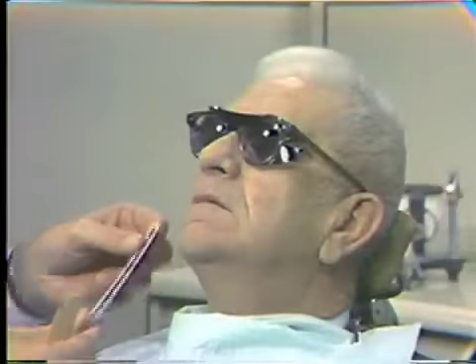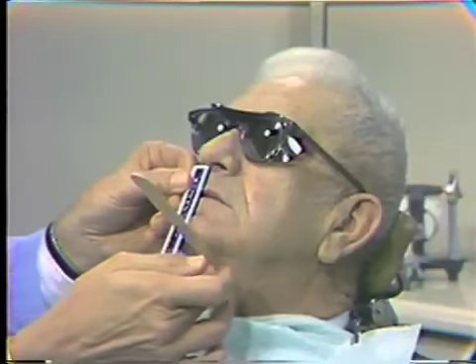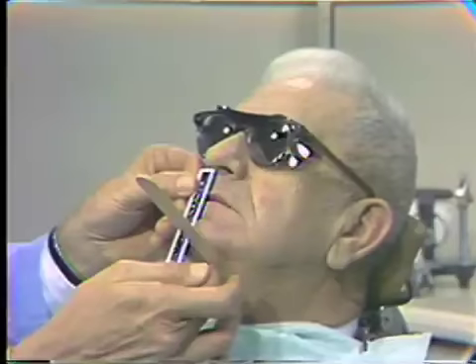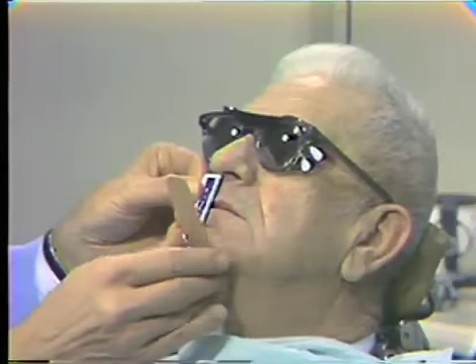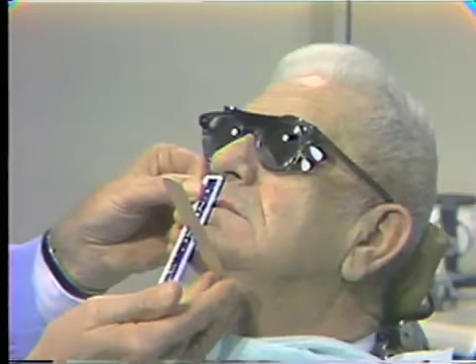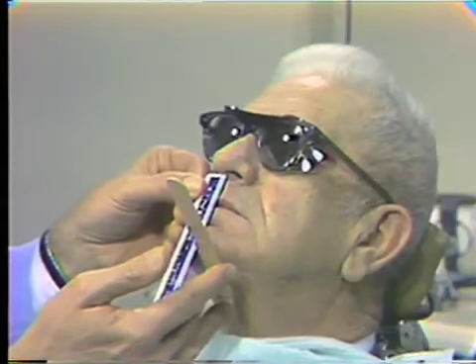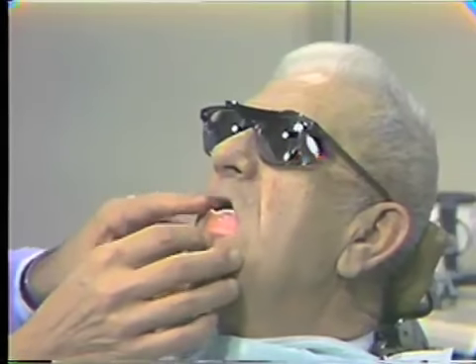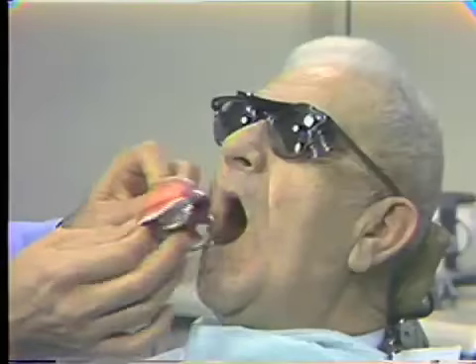And if you'll recall, we had a measurement of 66 millimeters before. And you can see here we have 68. So just squeeze again, bite a little harder. That's good. And again, we'll measure. And we are at 66 millimeters. Now open. And usually at this point, both rims will come out together.